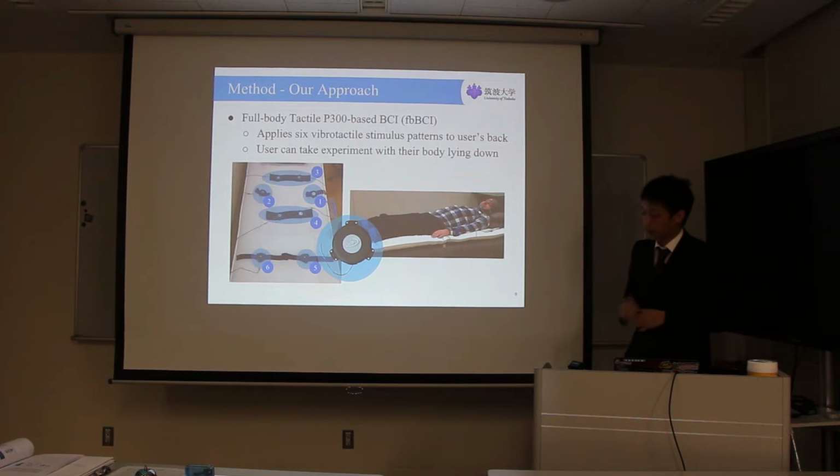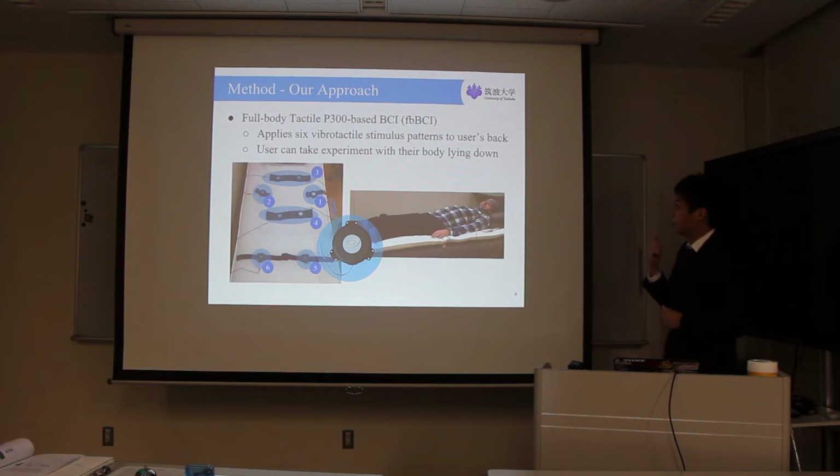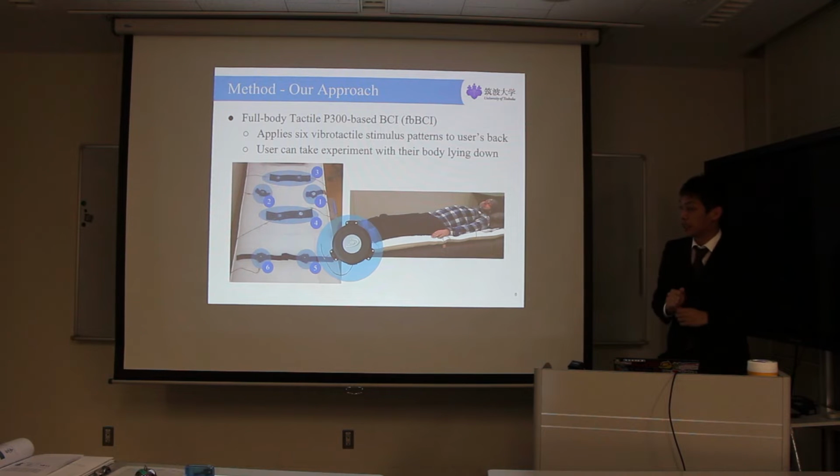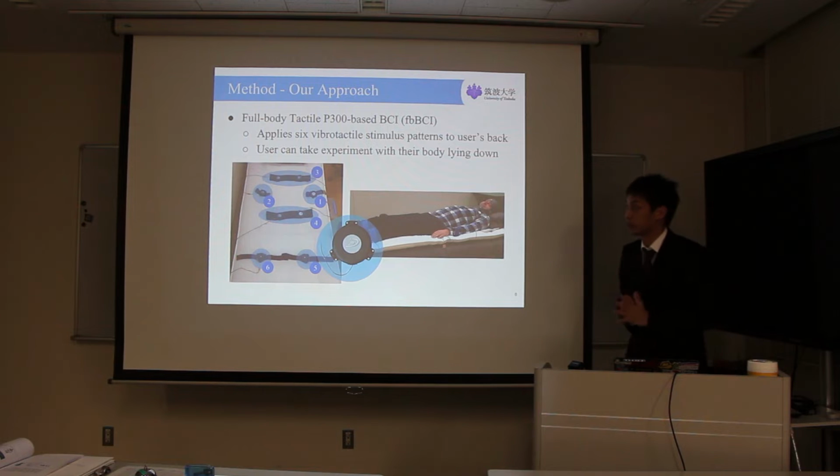Another benefit of this interface is that the user can join this experiment with their body lying down. Since most ALS patients are bedridden, it is very easy for them to join and use this interface.